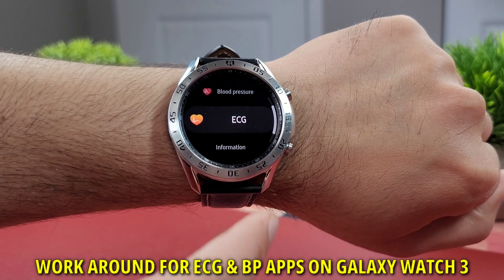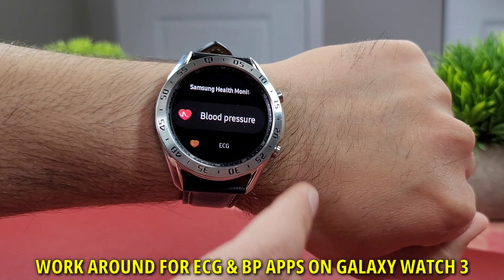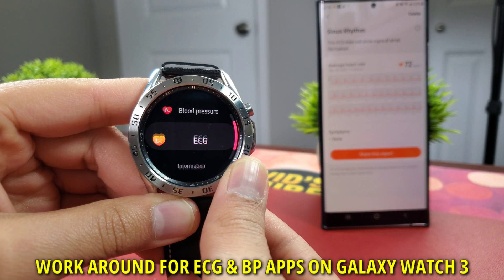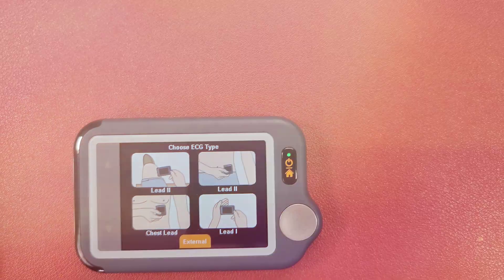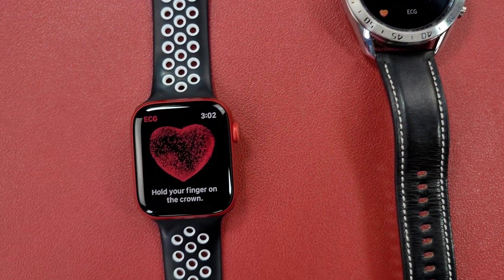Samsung promised ECG and blood pressure updates when the Galaxy Watch 3 was announced, but it's still not officially available at the day I am filming this video here in Canada. Today I'll show you how to install the ECG and blood pressure app on your Galaxy Watch 3 or Galaxy Watch Active 2 straight from your phone, and at the end I'll compare the ECG readings from this Galaxy Watch 3 to my Apple Watch Series 6 and the Fitbit Sense.